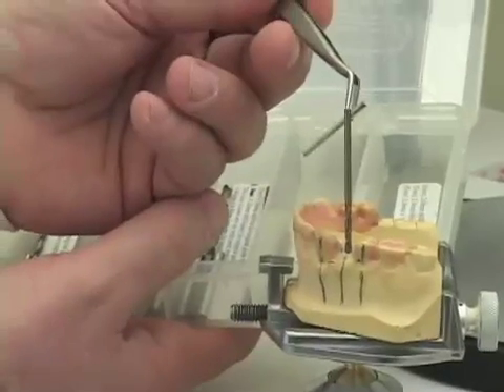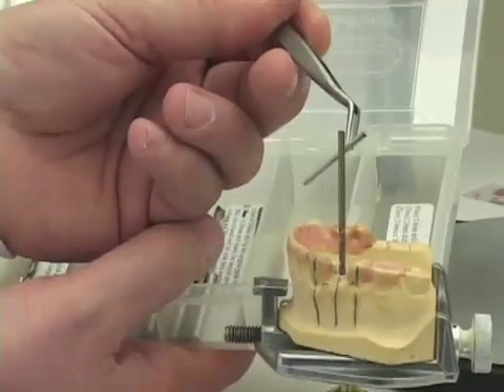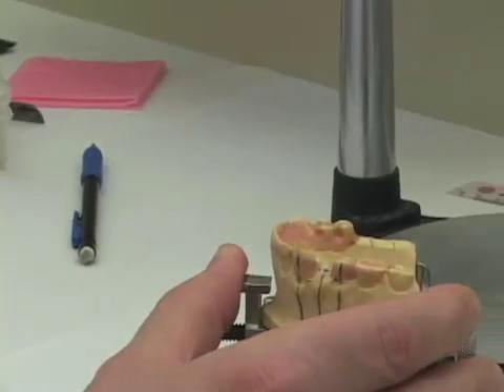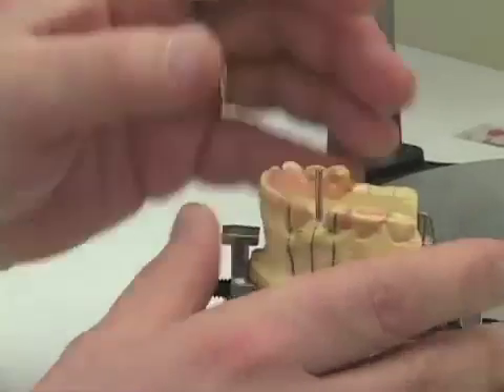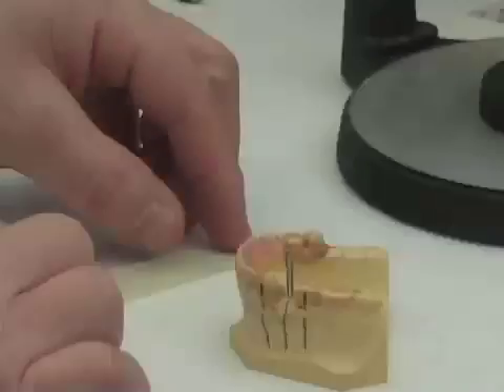In the box of drills that we get, there are also drill blanks. We're going to remove the drill from the hole we have made and insert the drill blank. We will then proceed with making our surgical guide.